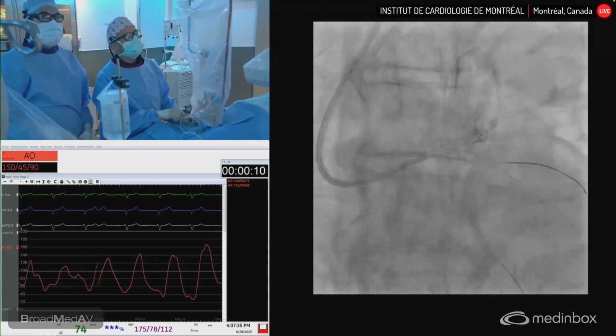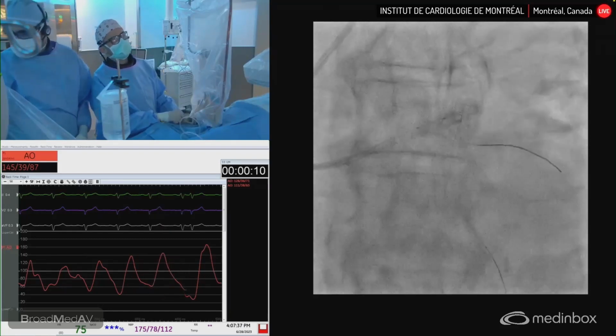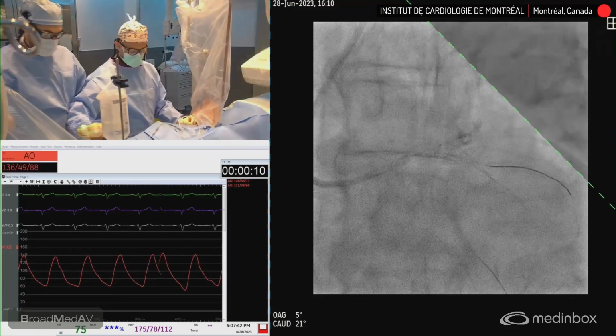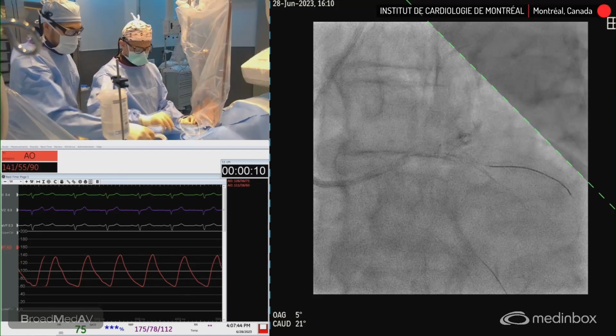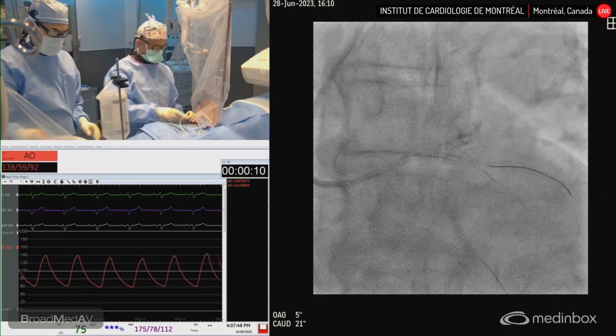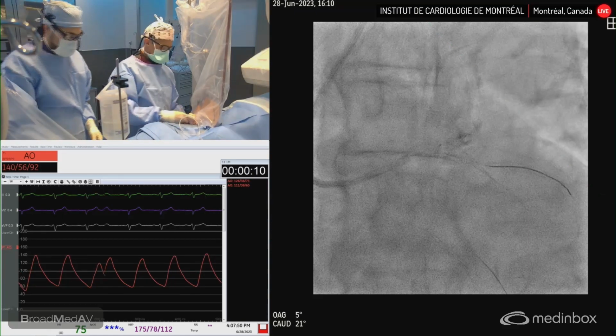You see, we keep going in Spider, but you see in this view, it's so much easier and we actually get less overlap. So we're inside. So let's bring the other balloon. Let's do a clean up here.